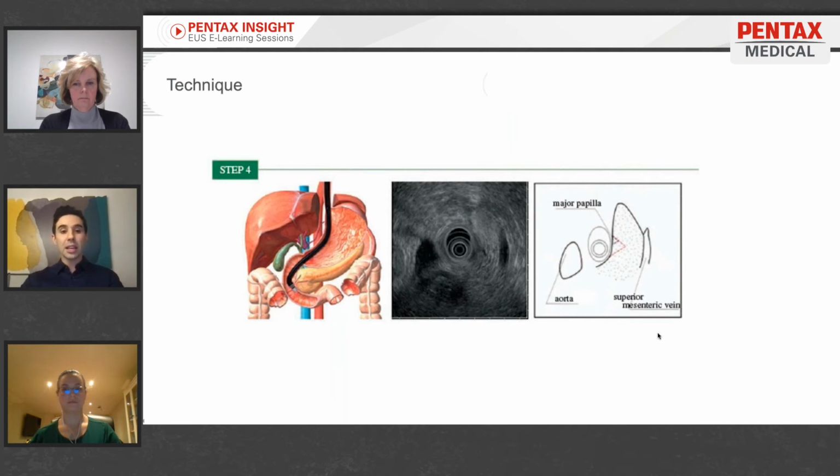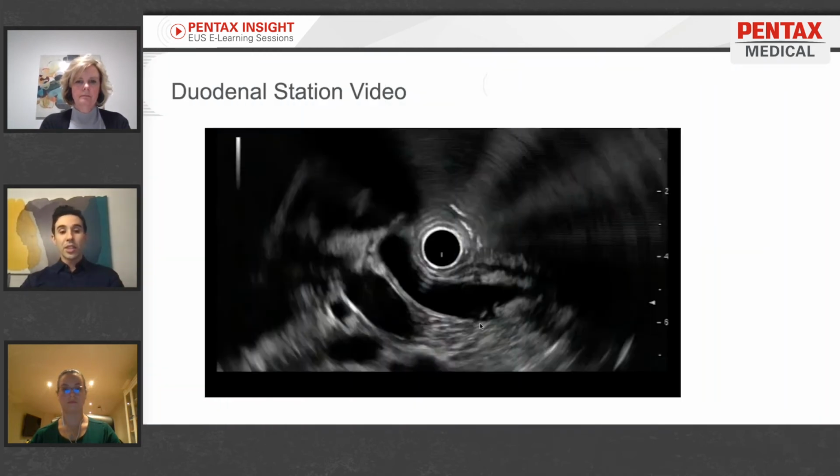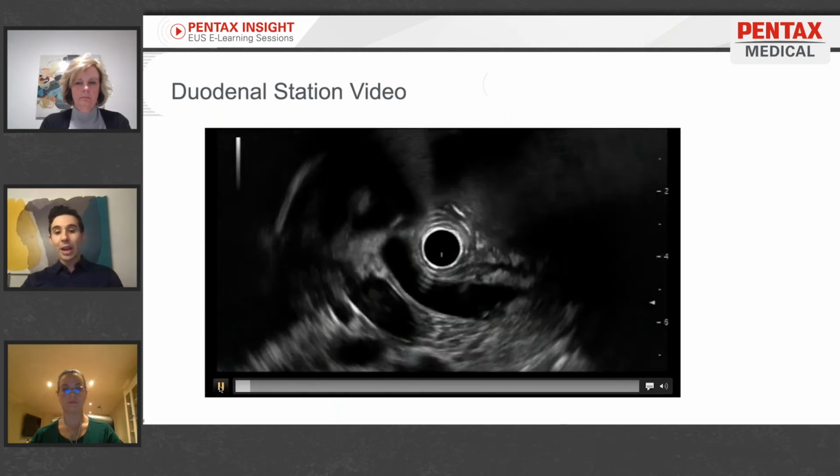And if I see that image, I know that what should exist between those vascular structures is the pancreatic head or the uncinate process. And so I'm able to find the vascular structures first and then zero in on the pancreatic uncinate. And so this is just a brief video trying to highlight this. So this is that pancreatic head station.